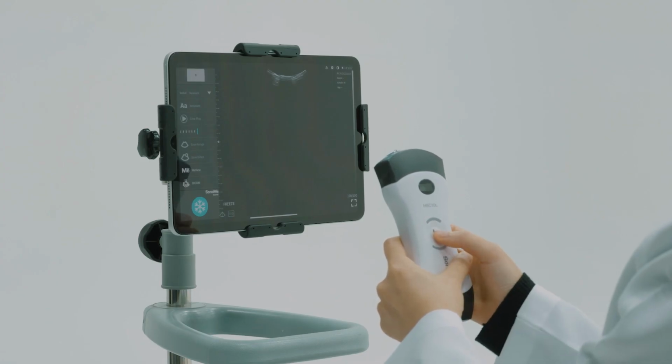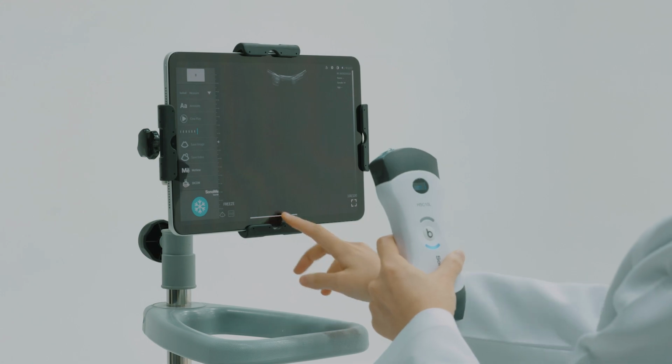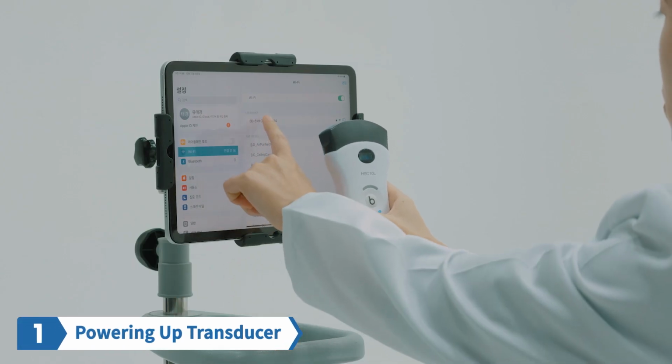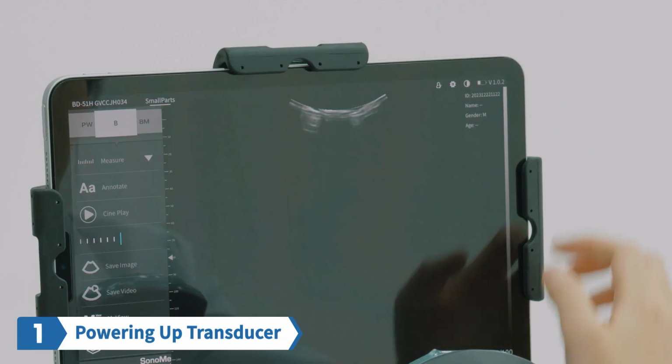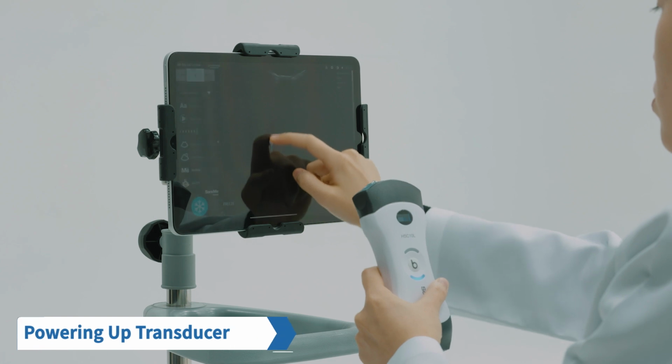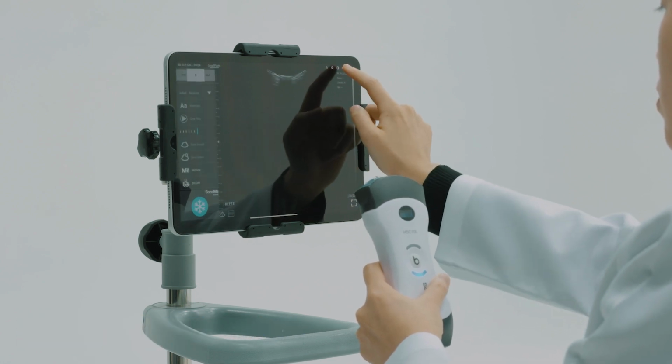Getting ready for an eFAST scan with the SonoMe dual-head transducer. 1. Power on the transducer and connect it to your smart device. Ensure that the display on the smart device is adjusted for optimal visibility, especially in bright emergency environments.